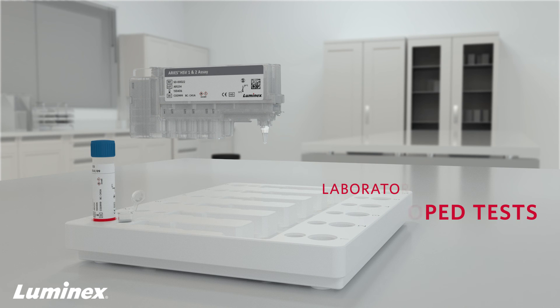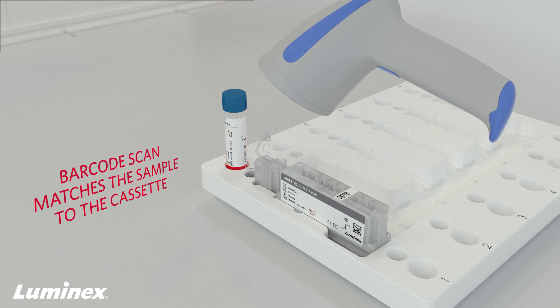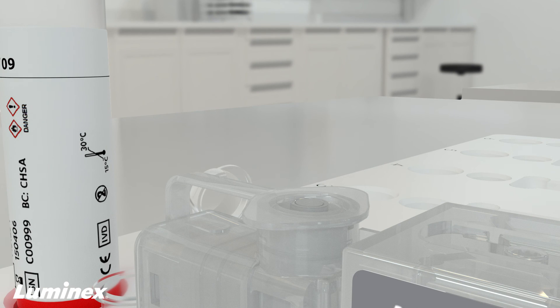To begin, scan the sample tube and the Ares cassette barcodes, which matches the sample to the cassette. Next, for IVD assays, simply pipette the sample into the cassette and close the cap.